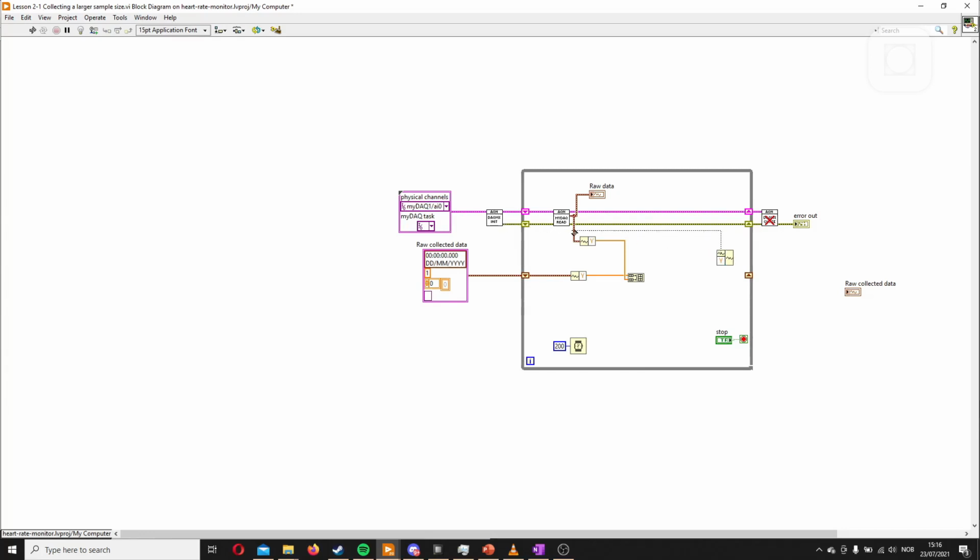and call ourselves done by just connecting this one here, and then the raw here. And this would work. It would now collect a larger sample size, and it would do so without a problem. It uses the old waveform here to collect the T0 and the delta T, so this would work. But now we don't control the size. We just get an unlimited size, which would overrun the application at some point because we just collect it for all infinite time, or as long as the application runs.